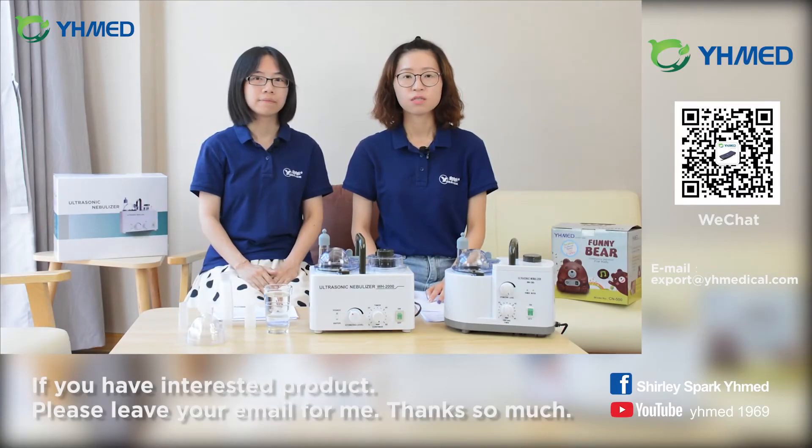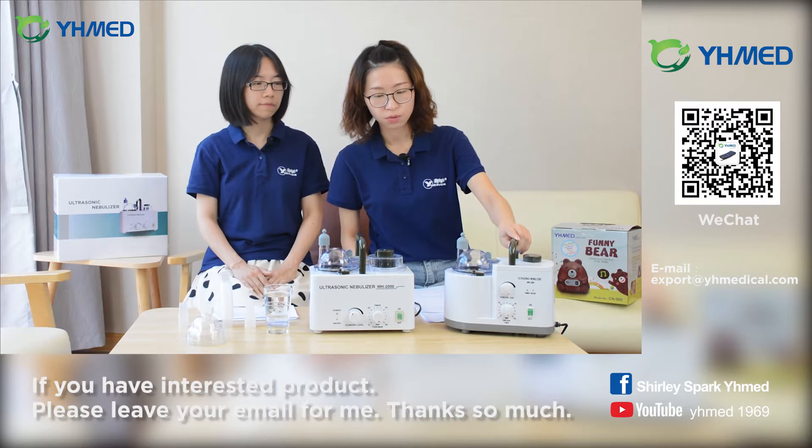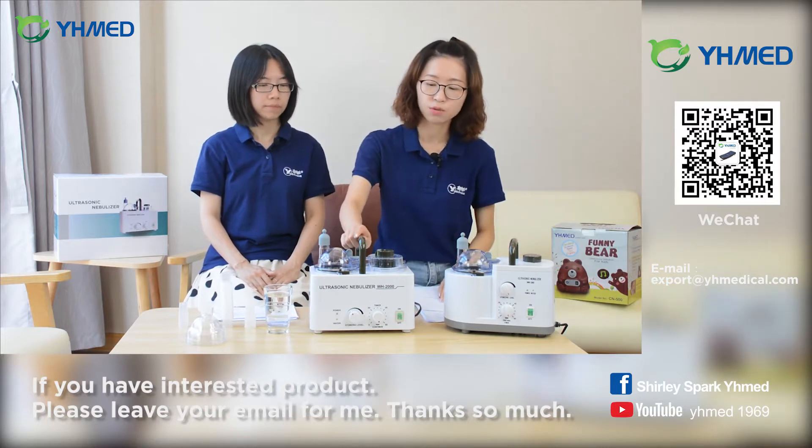Now we will introduce the ultrasonic nebulizer for you. We have two models: one is the WH203 and one is the WH2000.